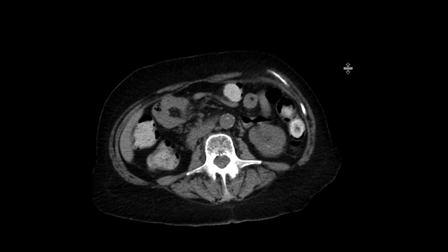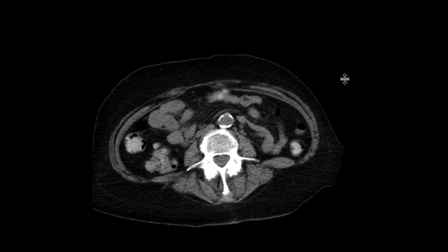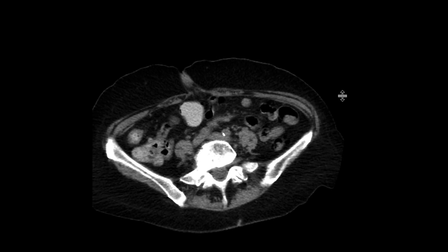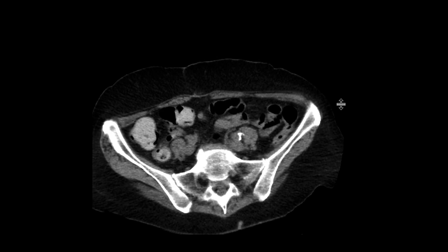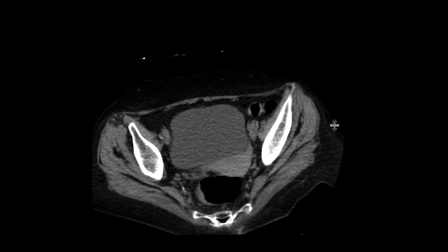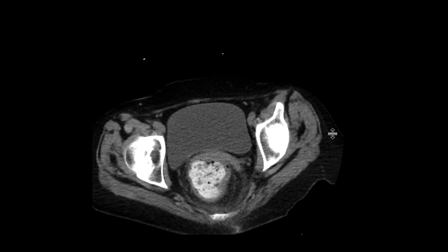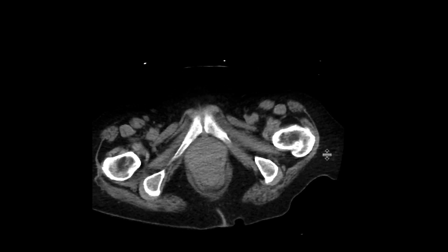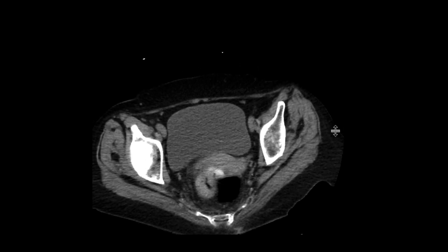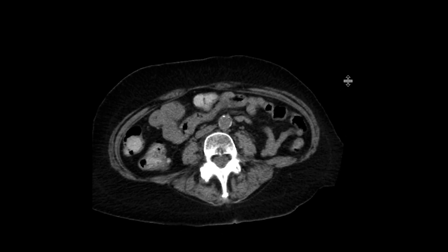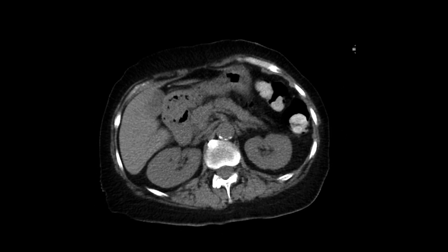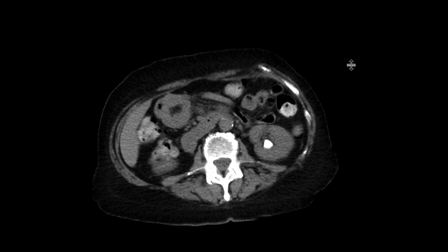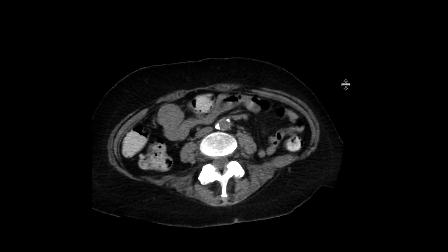We look down at the aorta and IVC in the retroperitoneal region — maybe a few small lymph nodes, but they're all subcentimeter in their short axis dimension. The bladder is moderately distended, a little bit of stool in the rectum, but no real significant inflammatory change. So just looking at it, there's nothing acute going on on baseline that we need to be worried about.